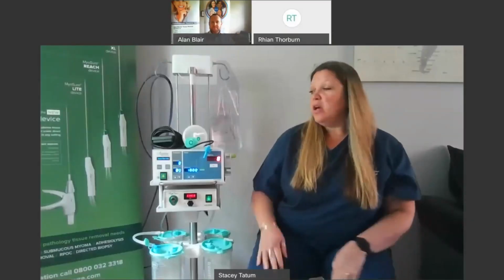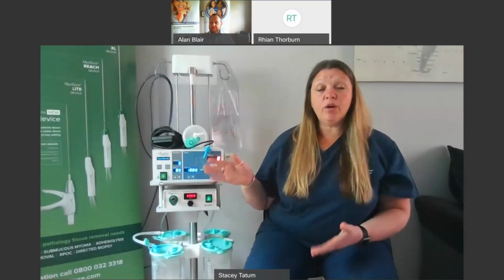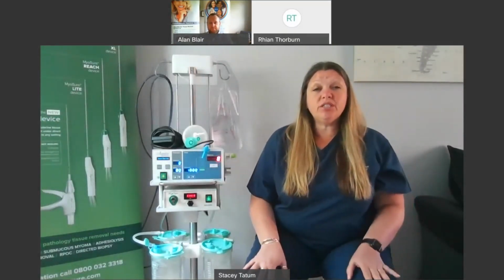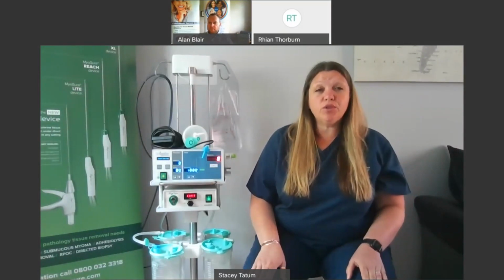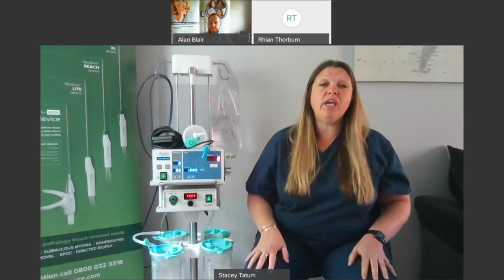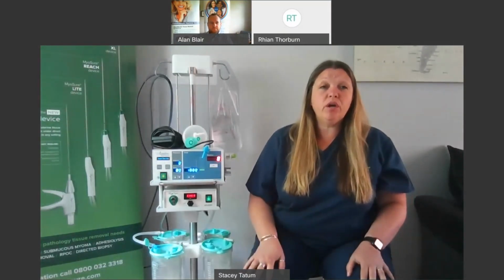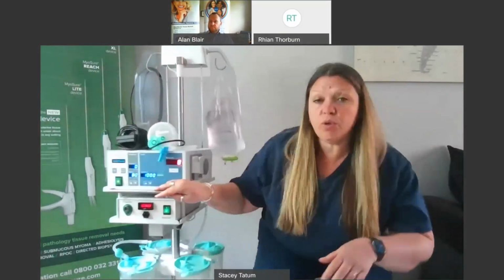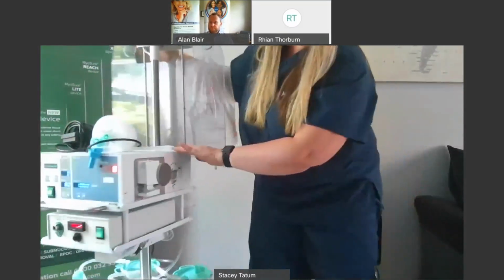Thanks, Alan. So you've got your machine out, you've switched it on, you've programmed the interface. Before the actual procedure starts, it's probably really wise to do a 2-minute checkover. If you complete this checkover, then hopefully it will save you having to troubleshoot during the procedure. So the first thing I would do is to turn your machine around.